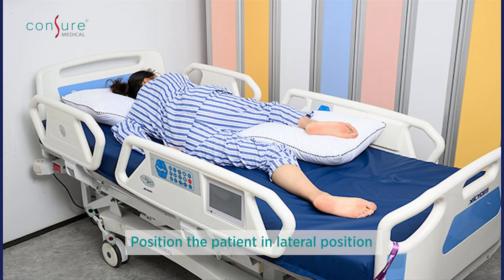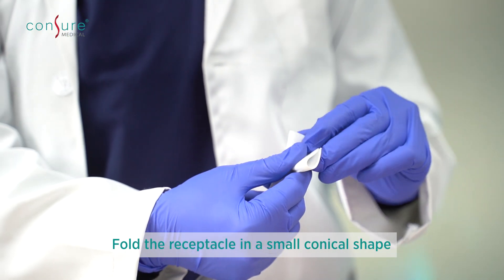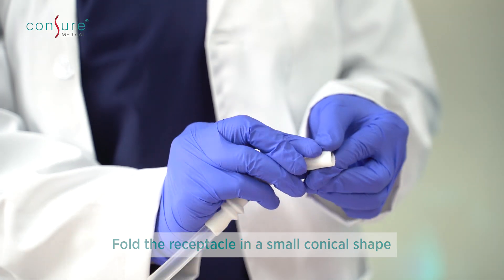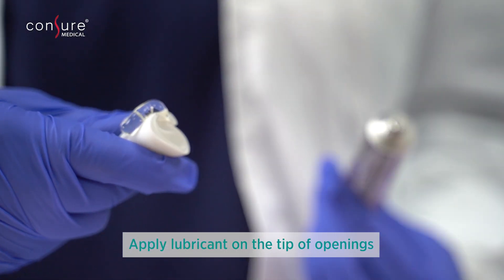Position the patient in left lateral SIMS position such that the anal orifice is clearly visible and easily accessible. Hold the receptacle between the thumb and the index finger and fold it twice to create a smaller conical shape. Apply lubricant on the patient's anal opening and the tip of the receptacle.